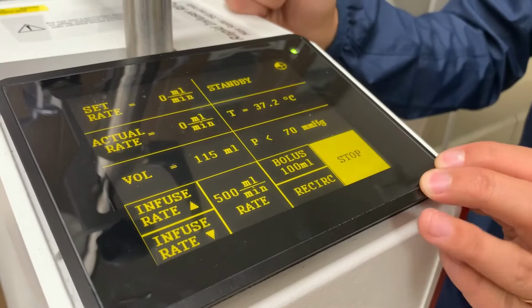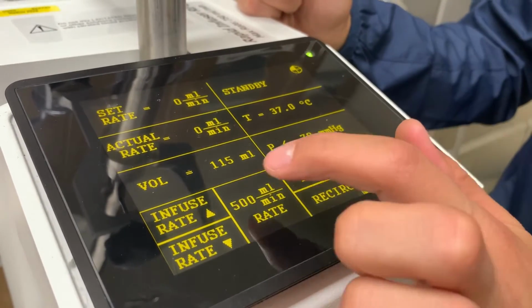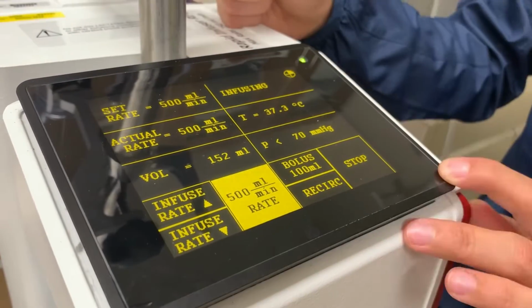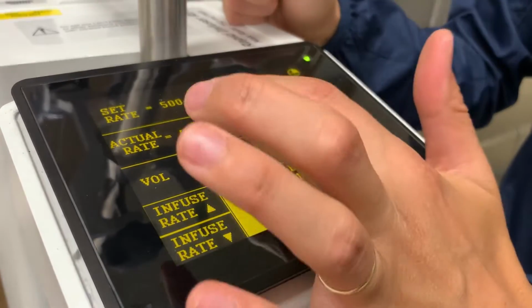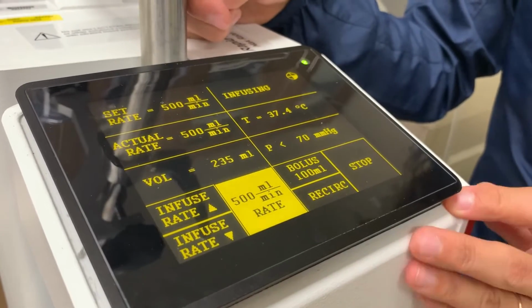Okay, once you have clicked infuse, a good starting point would be 500 milliliters per minute. You can increase or decrease the rate with these arrows right here. So this is telling you the volume that has been infused. This is telling you the actual rate. So say they were hooked up to a 20 gauge IV, it's not actually gonna go 500 milliliters per minute.